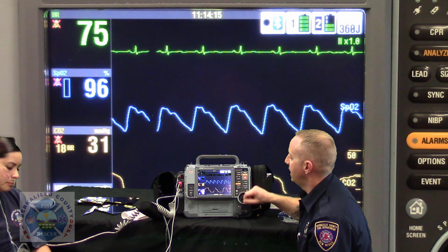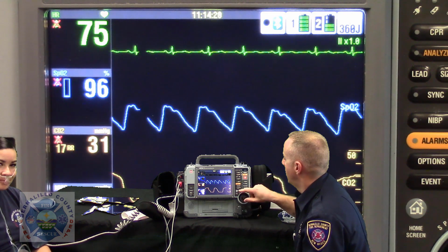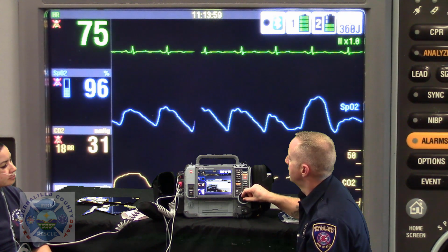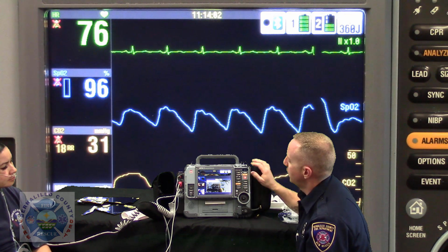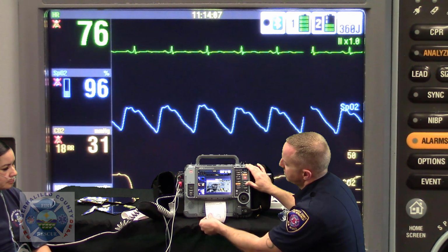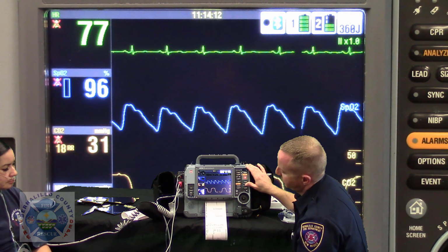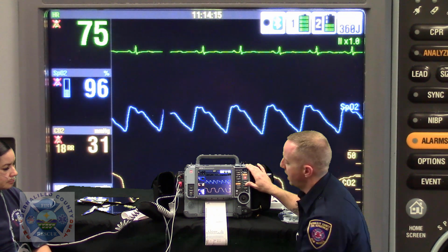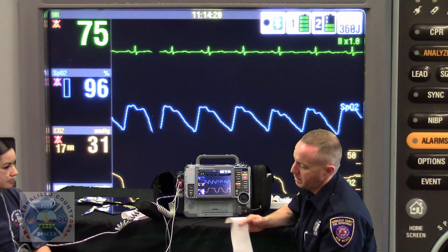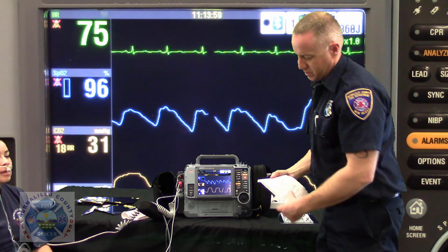Perhaps we've now moved on to morphine, and we've completed and rounded out the MONA acronym for our ACS patient. And now we're going to pass on our vital signs. Again, we'll go to options, print, change this to vital signs, and we'll burn this off, and we can pass off all of those timestamps of all of our labeled interventions to whoever needs a copy of this. And it's a very, very professional and methodical way of inputting patient demographics and patient interventions using the LifePack, and making this interaction go even more smoothly than it did before.